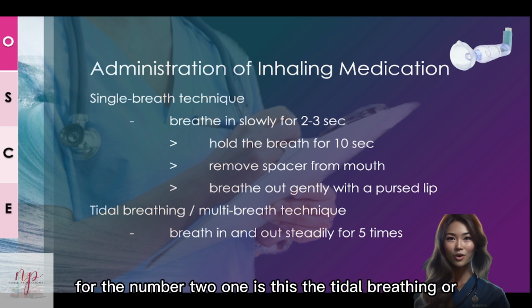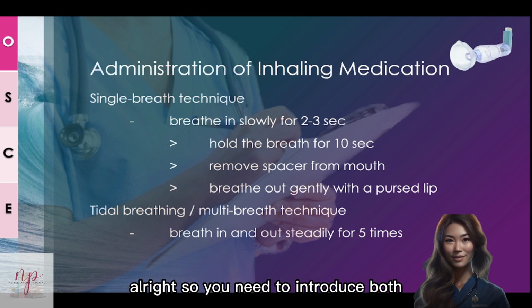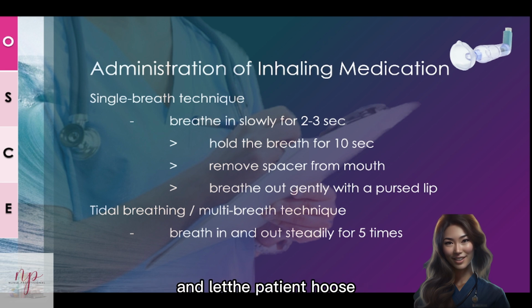Okay, number 2 is the tidal breathing, or we call it the multi-breath technique. It is easier because you just need to breathe in and out steadily for 5 times. Alright, so you need to introduce both techniques to the patients and let the patients choose.